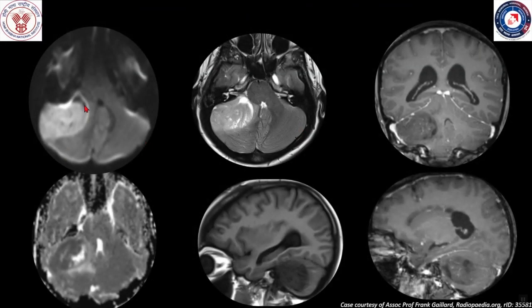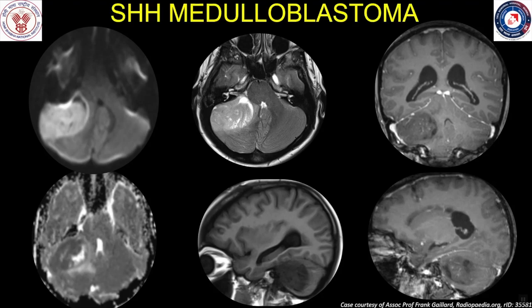This was a child who had a mass involving the lateral aspect of the right cerebellar hemisphere showing restricted diffusion on diffusion-weighted images, dark on ADC maps, iso-intense to the grey matter on T2-weighted images, hypo-intense on T1-weighted images, and showing heterogeneous post-contrast enhancement. The mass extended to the surface abutting the tentorium cerebelli. When such a mass is encountered in a child, a diagnosis of SHH or Sonic Hedgehog type of medulloblastoma needs to be considered.